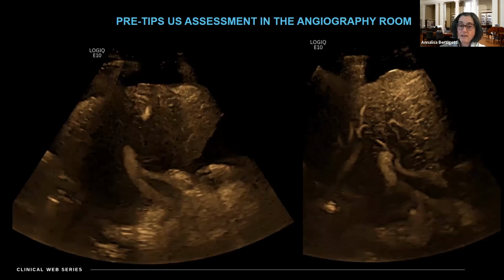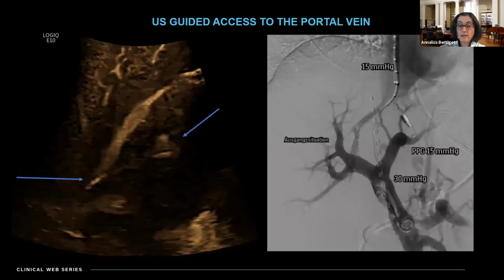We always, in the angiography room, check again the patency of the portal vein with imaging, and I could use this new technology, and you can see how well you can see the thrombus in the portal vein, and how well you can identify the liver vein and the portal vein on the same axis, allowing you then to guide the puncture to the portal vein from the liver vein in a very easy way. And you can see from these arrows on the left, this is the needle that we put, of course, from the liver vein to the portal vein to access the portal vein and put the TIPS in.